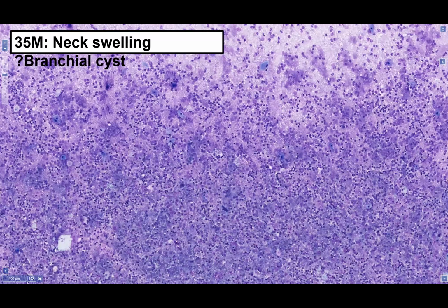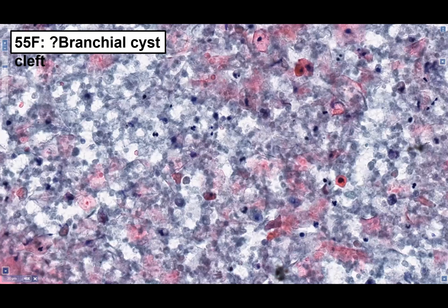So these are very typical features when we have a nice case, that you have these superficial or intermediate squamous cells lacking cytological atypia, some of them anucleated with this keratinous debris. You may have the case of cholesterol crystals, that this is a long-standing lesion, and some mild atypia. And these are non-specific findings, squamous cells of various maturity, background of some lymphocytes and macrophages.